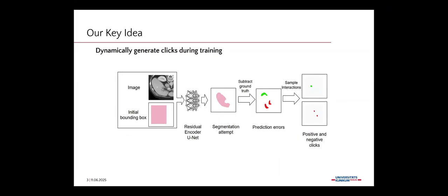Of course, we dynamically generate the clicks during training. We tried some different approaches, but in the end we found that, maybe unsurprisingly, if during training we generate the clicks exactly the same way as during evaluation, that was definitely best in our validations.